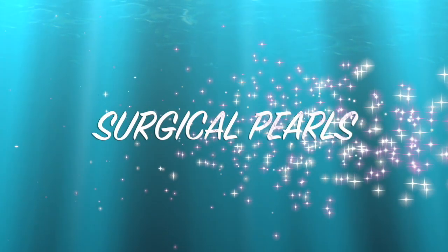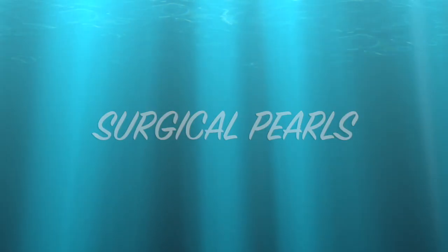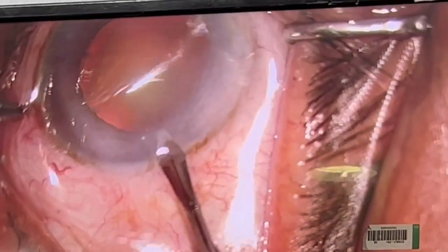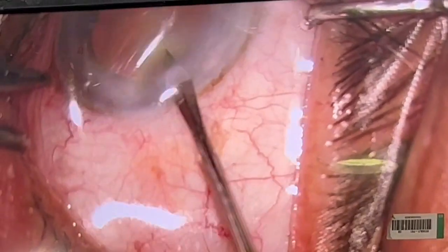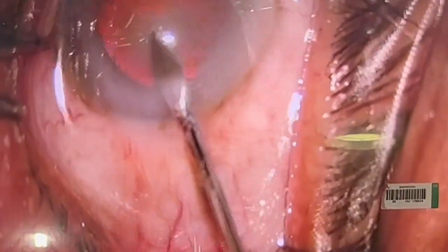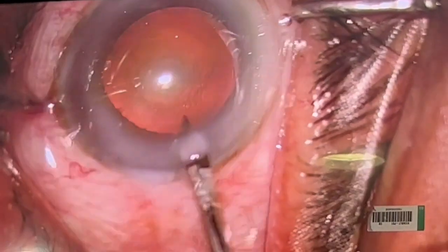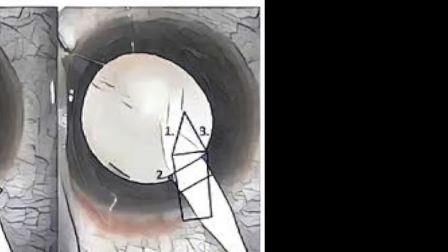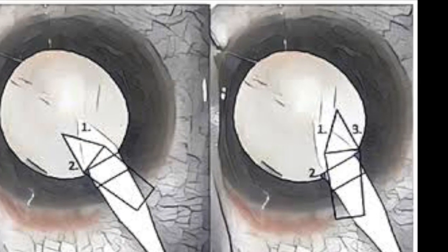Let's look at the technique, and now let me give you a few surgical pearls that work for me. Your 2 mm incision has to be more anterior than what you would like for a cataract surgery. What you want to do differently over here is flare the internal lip of the corneal incision to ensure a wider treatment arcade.